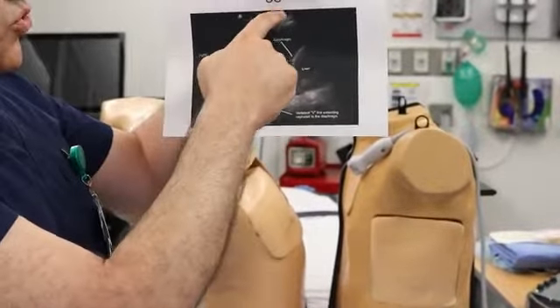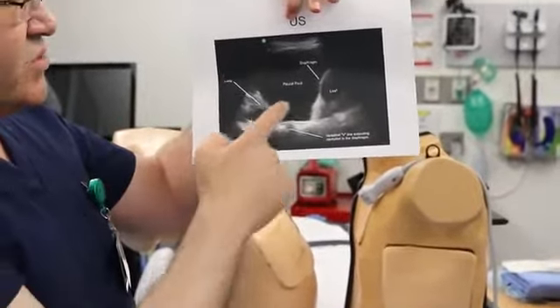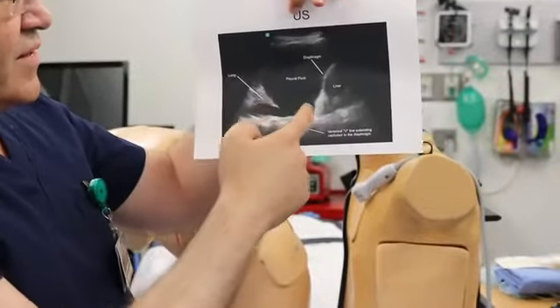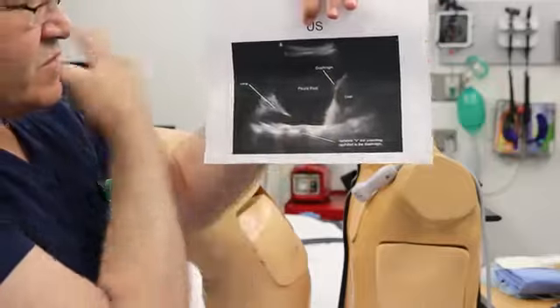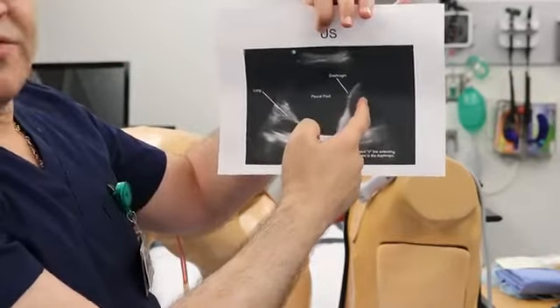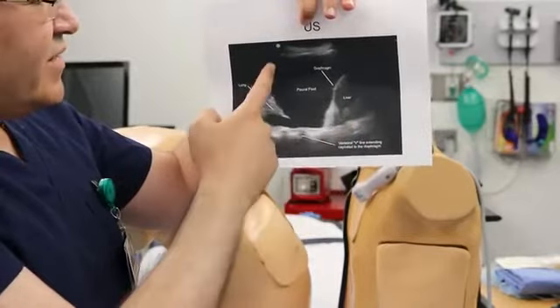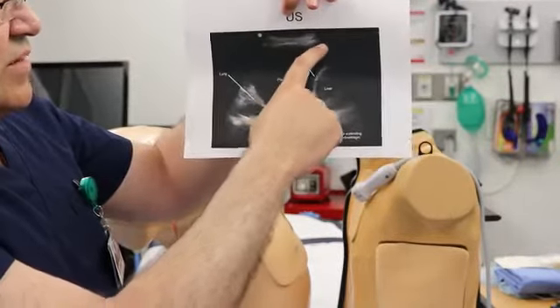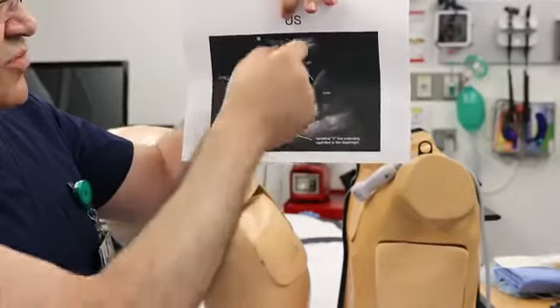Here is where your probe, here is the skin, and this is your fluid. This is how your fluid will look, black fluid. And above the diaphragm, because we said head is here, below the diaphragm here, this is the right side, so you'll have the liver. If you are on the left side, you'll have the spleen, and this is your collapsed lung. Here are your ribs. You should see some black shadow from the ribs.